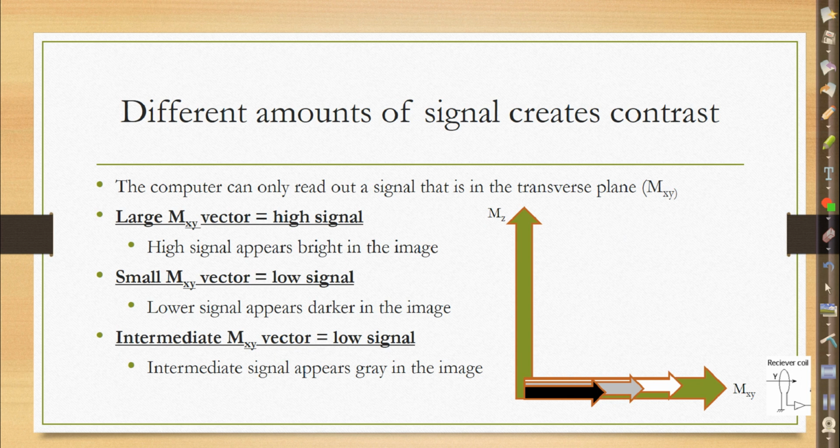All right, so last year, we really talked about how we get basically our net magnetic vector that usually sits right here along B sub 0. What's B sub 0 stand for again? I think you had it right there. Go ahead. You're saying the static magnetic field. Yeah, B sub 0. And remember, that aligns with M sub Z, our longitudinal axis.